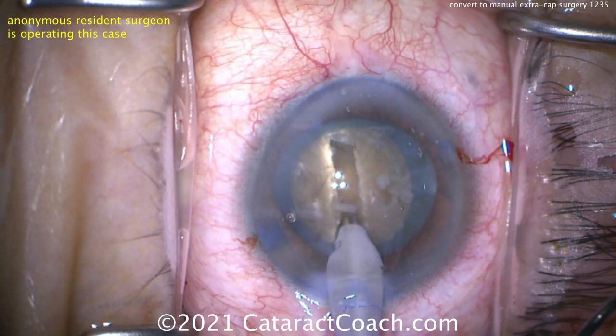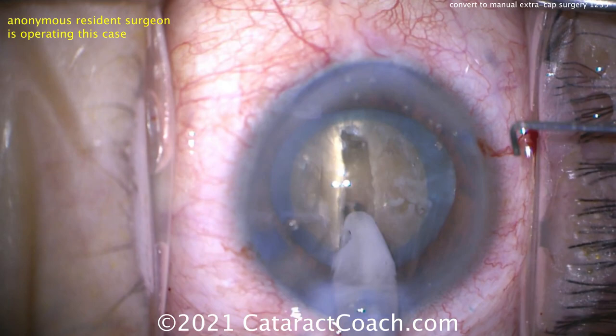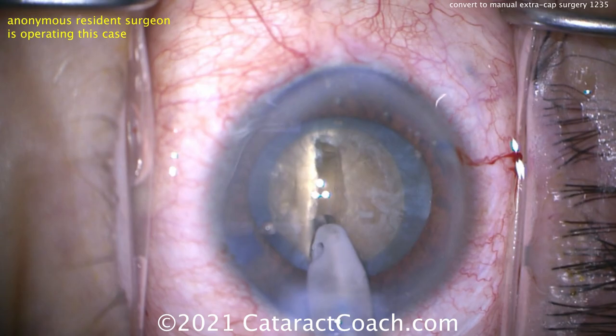Grooving a central trench in the nucleus. Keep in mind it's a small anterior segment and we've got to get this big nucleus out of there. Doing the groove, the case looks pretty reasonable. But when we fast forward, you're going to notice an ominous sign.